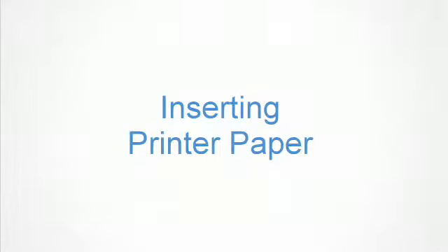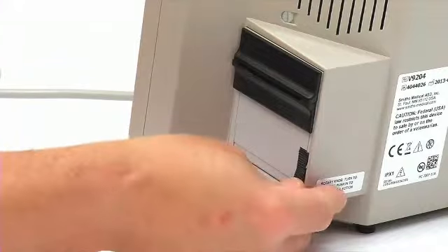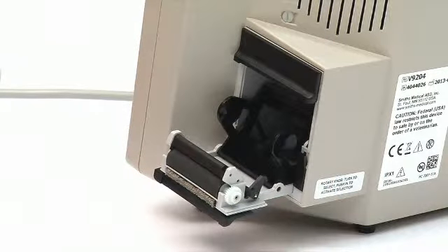Inserting printer paper. Use only replacement printer paper that is specified for this device. Using any other printer paper may produce undesirable results or may damage the printer. Open the printer door on the right side of the printer. Gently pull the door down until it's completely open.